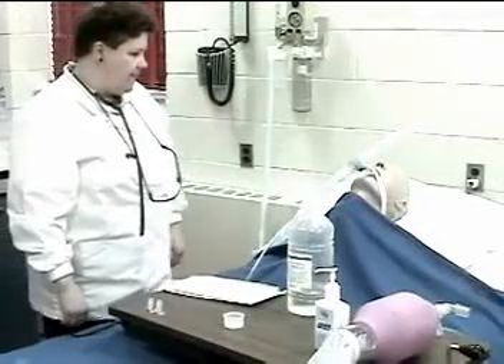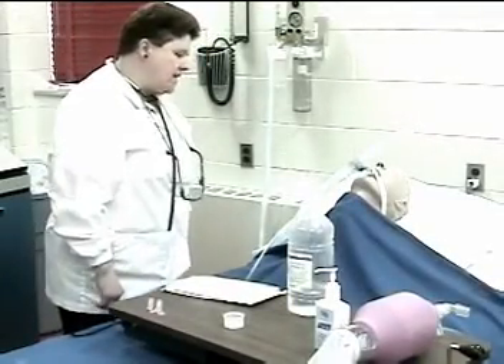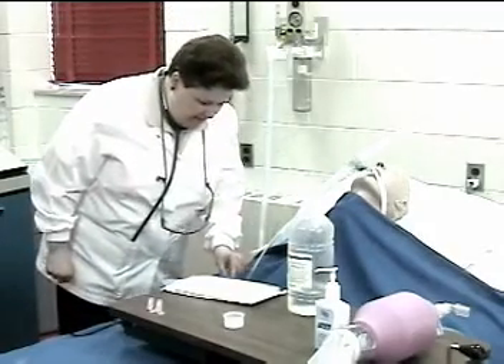Introduce yourself and identify the patient. Good morning Mr. Smith, my name is Brenda and I'm from the respiratory care department. Can I just check your name band a minute? Thank you.